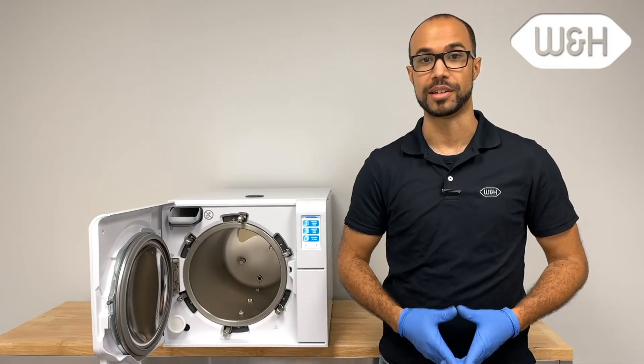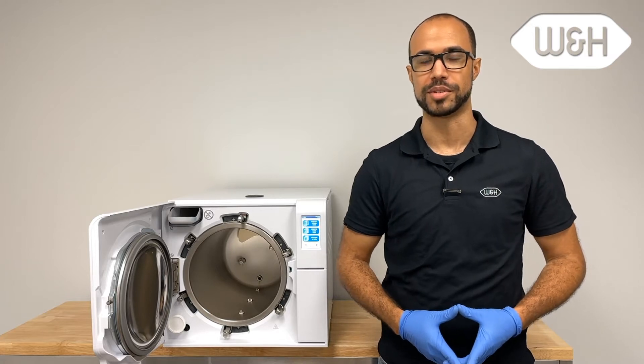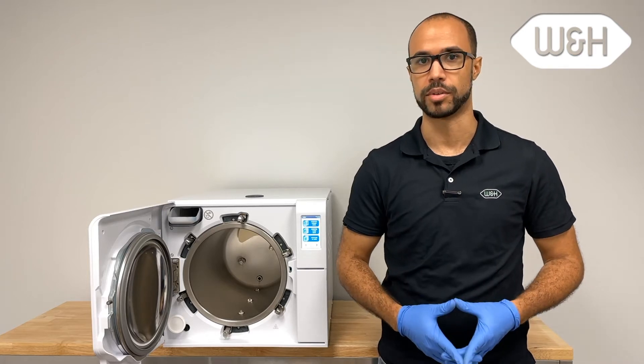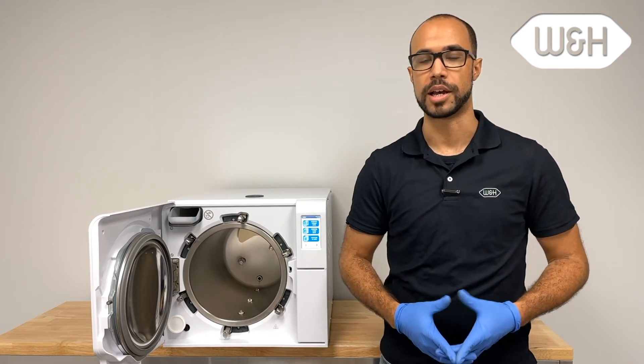Hi, my name is Randy and I'm a repair technician here at W&H Impacts. Today I'd like to introduce you to the Lexa Sterilizer cycle programs, loading the chamber, and how to run a cycle.